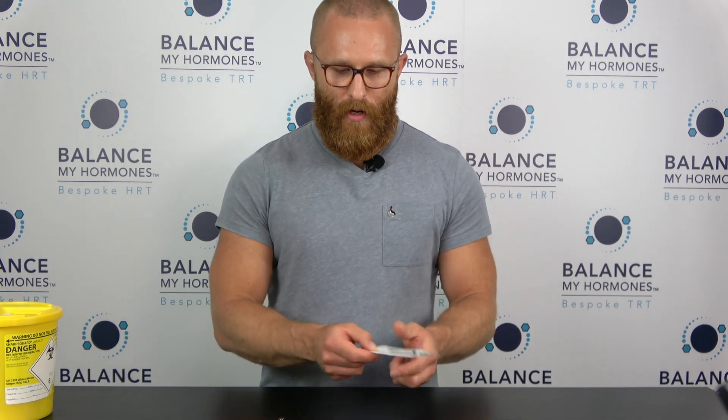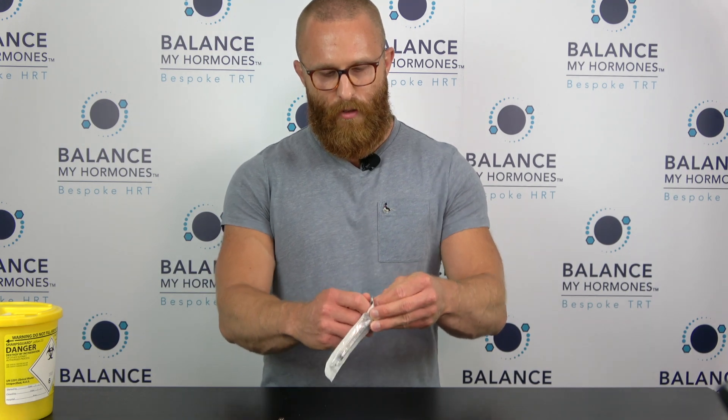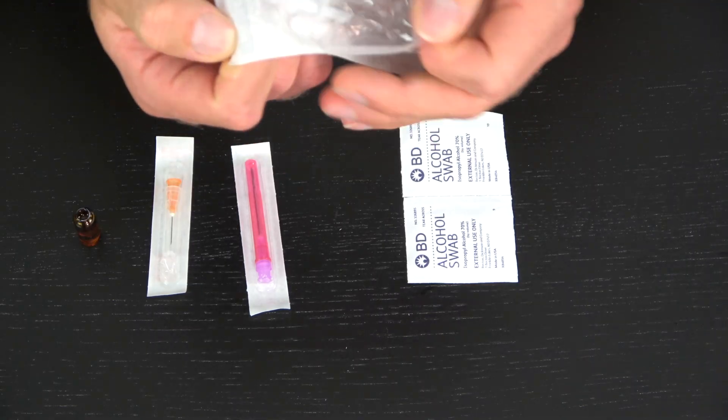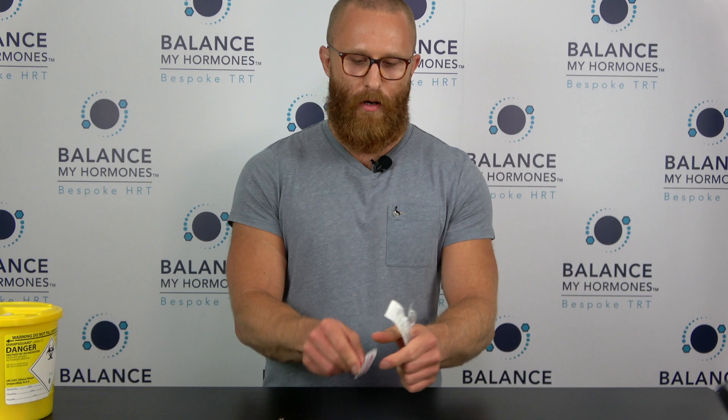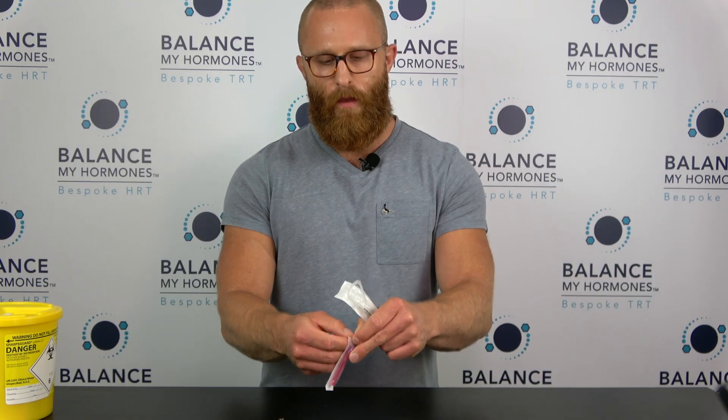I'm going to leave that down for a few seconds. The next thing is we're going to get our syringe and our filter needle. I'll open this syringe here and get my filter needle.